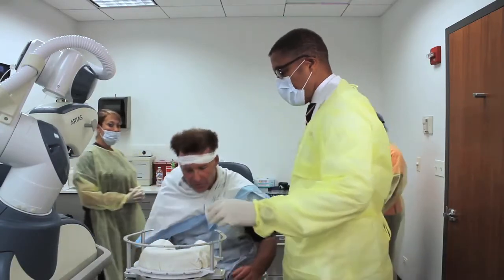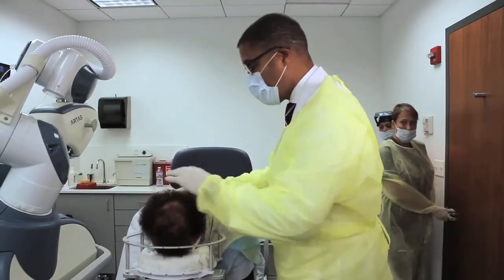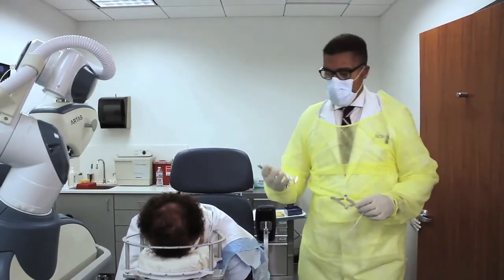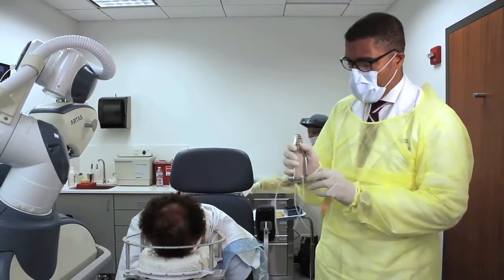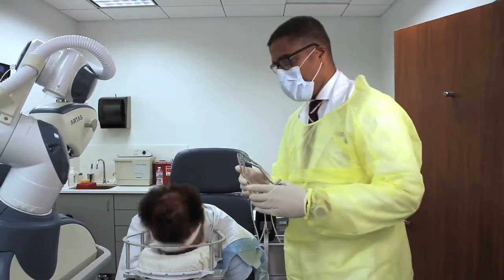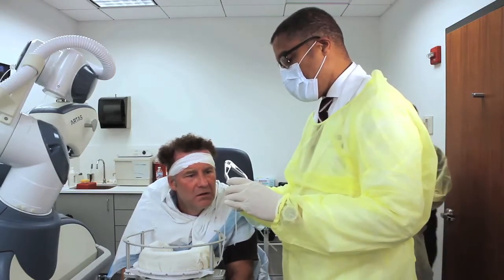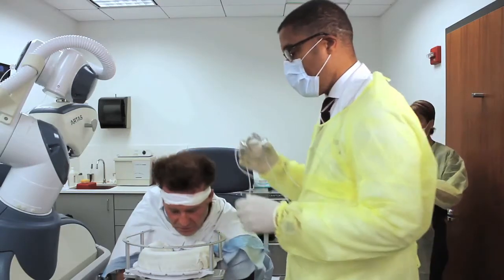So why don't you put your head right in there? Scoot up there, kind of get comfortable as you can. So what I'm putting on now is called a tensioner. Lift your head up just one second. With the camera on the computer, this goes in here, takes a picture of your scalp, and actually punches the hair in this little square. That's all that's going on.